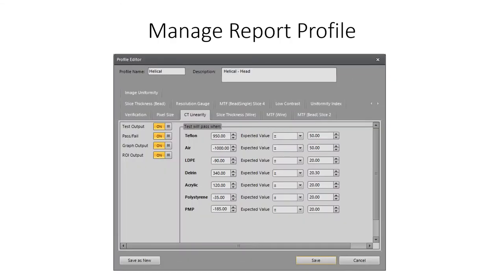Our report profile manager gives access to each image quality parameter to control output and modify pass-fail tolerances. Two default report profiles are provided for each phantom. One profile is the complete report with all output features turned on, and the second default profile creates a report that excludes all images, graphs, and charts. Users can create new site-specific report profiles by editing either profile, then saving as new.